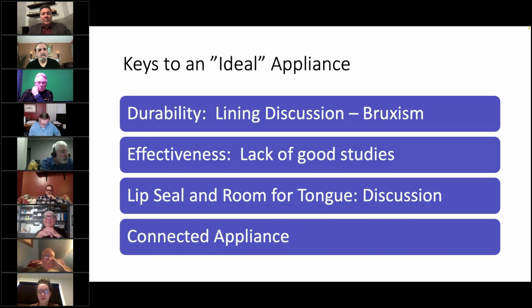And when I was doing the Somnic, the LVI came up. They're the ones who came up with the lingualess Somnodent, which made no sense to me and still doesn't, because when we challenged them to do a study, because they were doing a lingualess Somnodent at a neuromuscular position, they told me they were doing it, and then somehow I don't understand it never got published. Anyway. We do want the lip seal, which I don't know is problematic with the new TAP Flex. I'm not sure. It seemed that it certainly was a problem with the TAP 1, and the TAP Flex is like that.